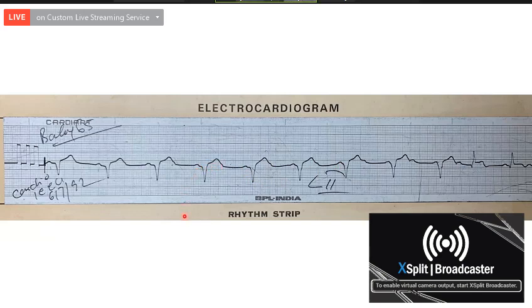But your statement that it is 2:1 conduction may not always be correct, because the PR interval is becoming shorter and shorter, and the P has gone through the QRS. Yes, sir. So what do you think it is? Isorhythmic AV dissociation. No. In isorhythmic AV dissociation, you can have only one P wave. Here there are two P waves.